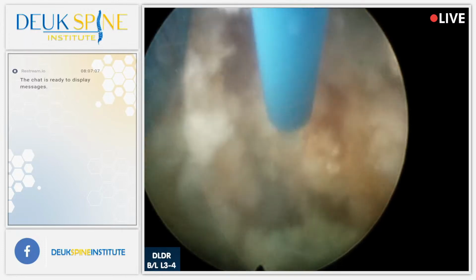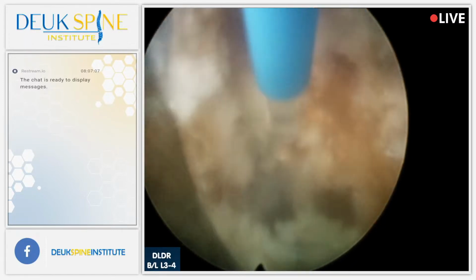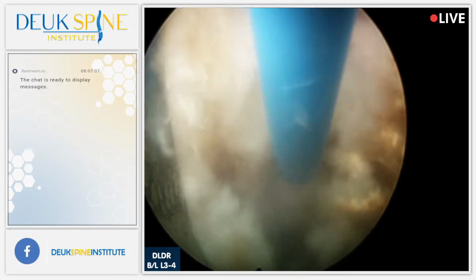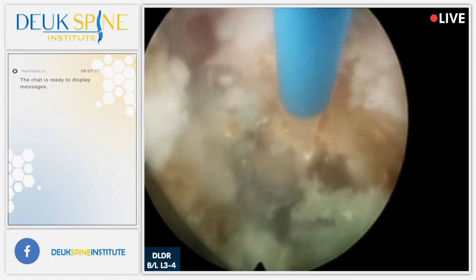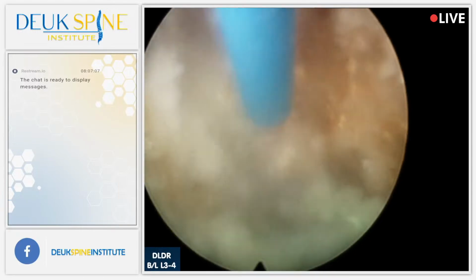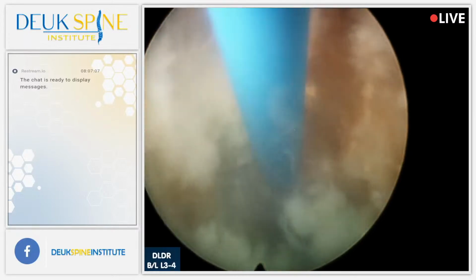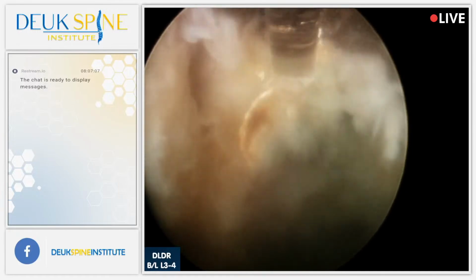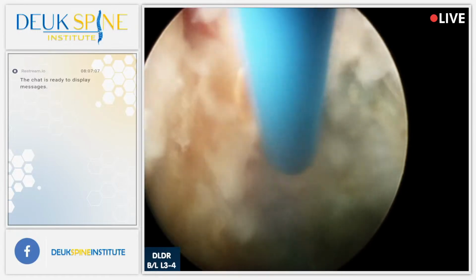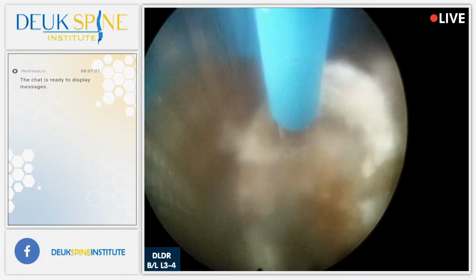Sure, I'll take the question. First question comes from Food is Life and Love on YouTube. Hello there, and welcome. Thanks for joining us. They ask, what would be the reaction by the patient as you are close to the root? I think that was from earlier. So if I'm too close to the nerve root, the patient will say, ow, I have pain shooting down my leg. And then we stop and we redirect to another location.